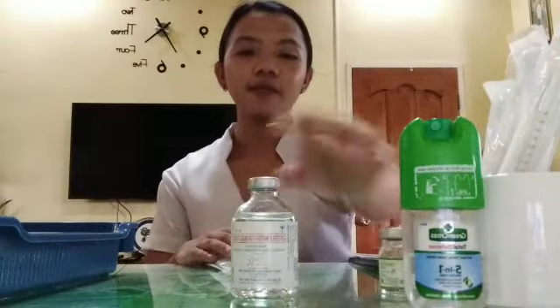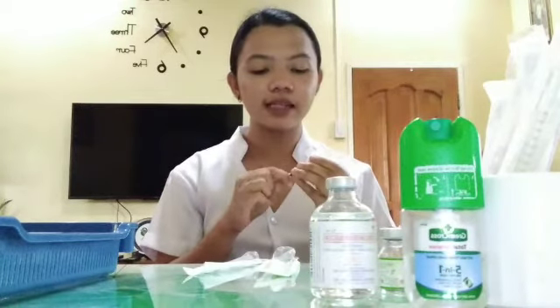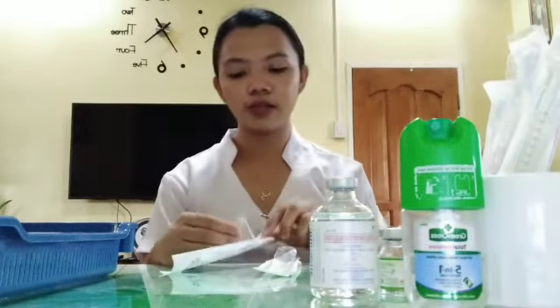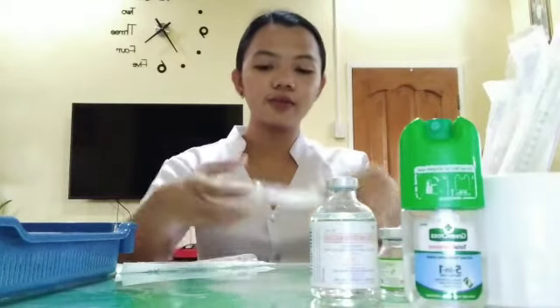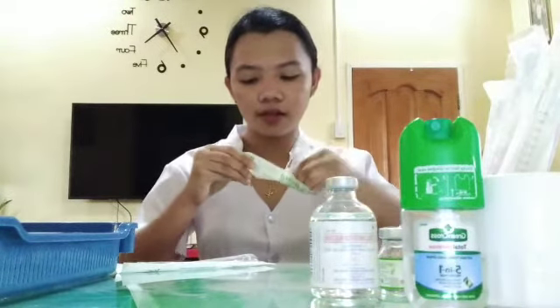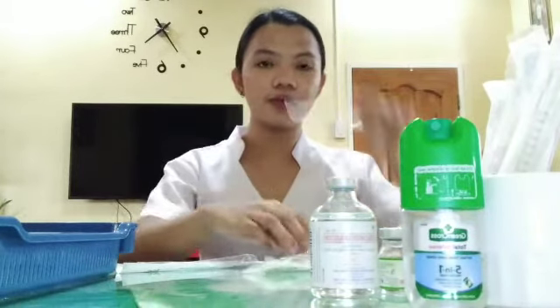After picking it up, we will change the needle of the tuberculin into the aspirating needle gauge 25. So we will secure it and we will change into gauge. So here it is.